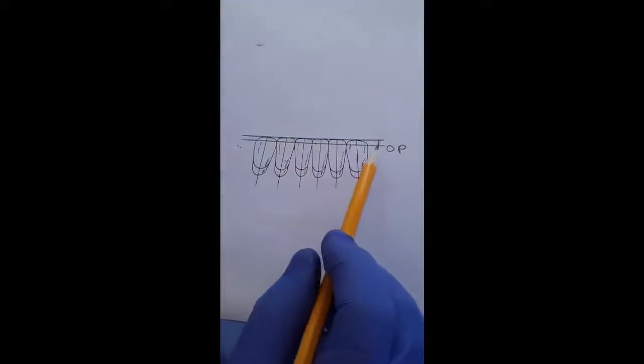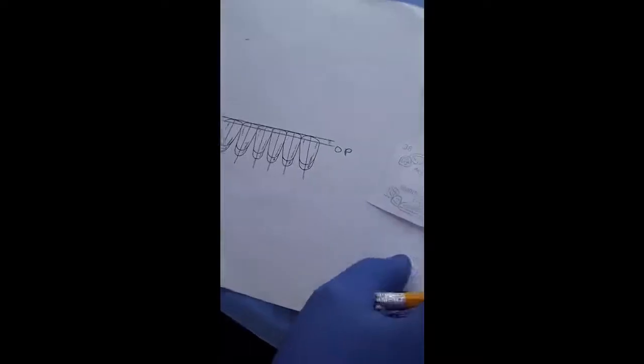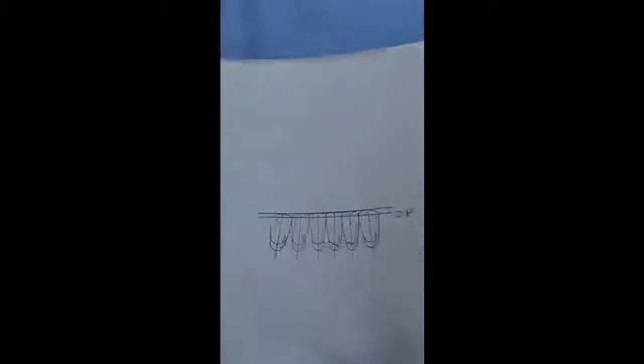Okay, but now we are going to start setting the teeth tooth by tooth and see how we are going to achieve the goals for setting of the lower anteriors.